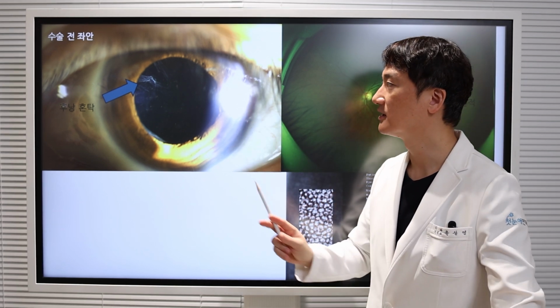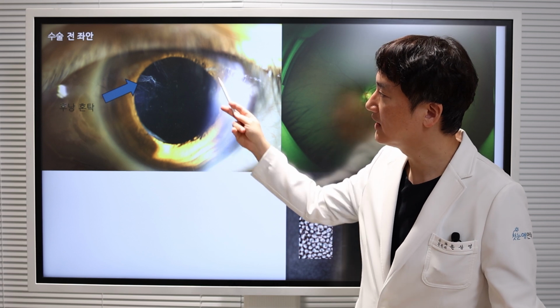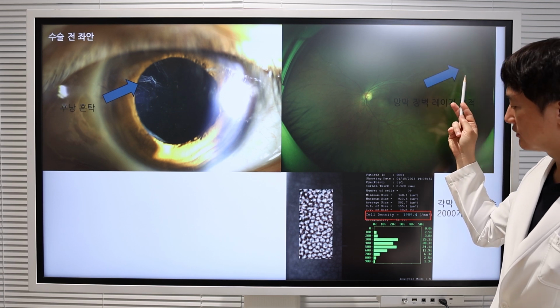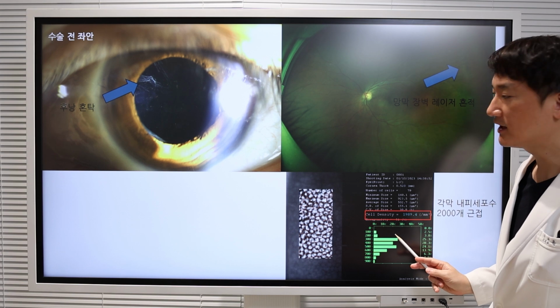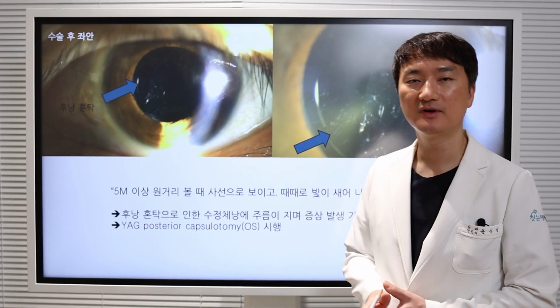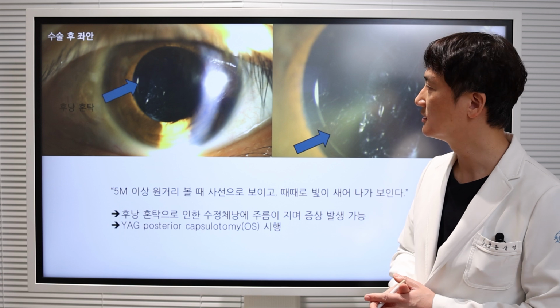When considering the possibility of resurgery, it is essential to thoroughly assess the condition of the initial procedure, especially focusing on whether the anterior capsulotomy was performed well and if the corneal endothelial cell count remains healthy. If these conditions are satisfactory, resurgery can be approached with less concern as we manage to correct the issue using the same intraocular lens platform. We adjusted the astigmatism in the lens.